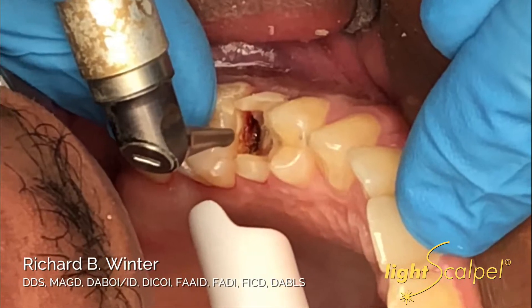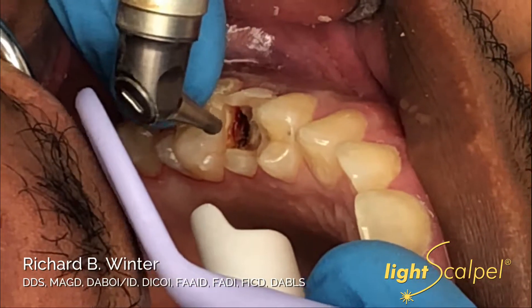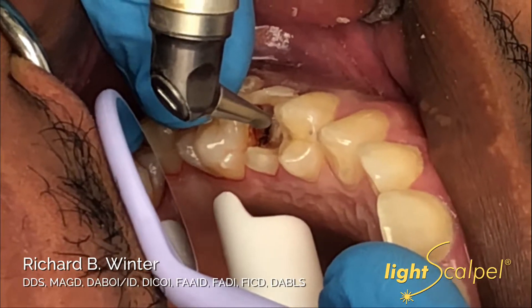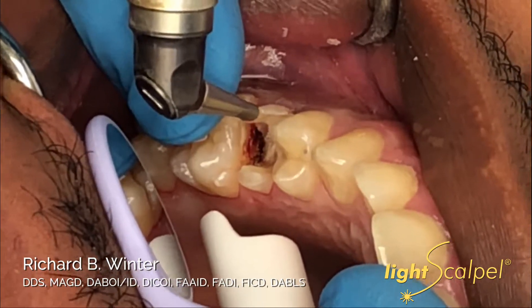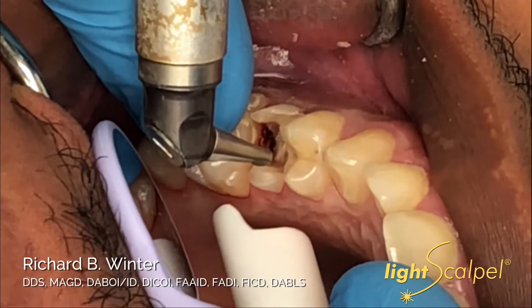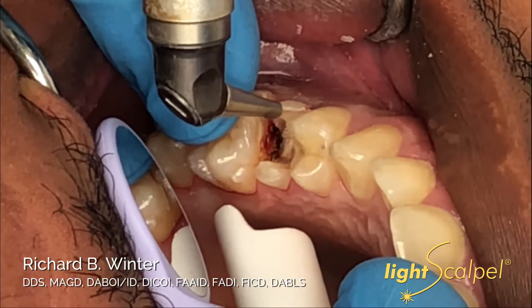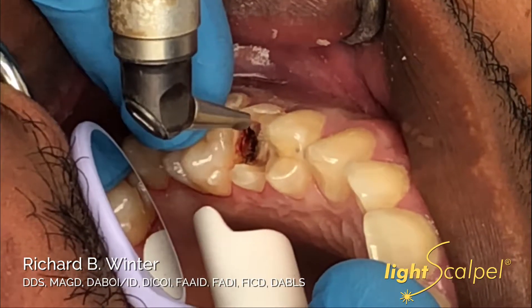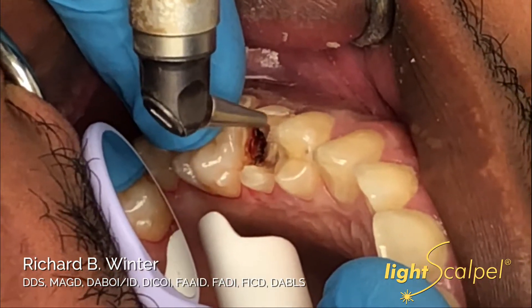If there's a little bit of char around the tooth, that's not a big deal right now, because we're going to go ahead and remove that. Now we're going to remove the tissue that's hypertrophied and invaginated into the cavity. We're making a little trough right along the tooth so that we have enough to get our 170 XXL bur in. Could you rinse that please, Julie?